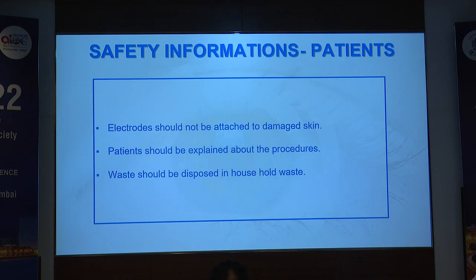To conclude, electrodes should not be attached to damaged skin. The patient should be explained the procedure, and waste disposal should be done thoroughly in the household waste.